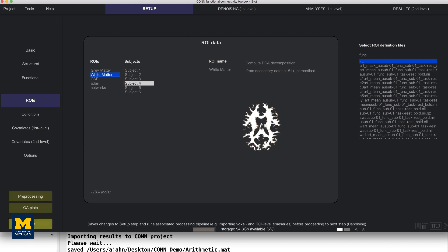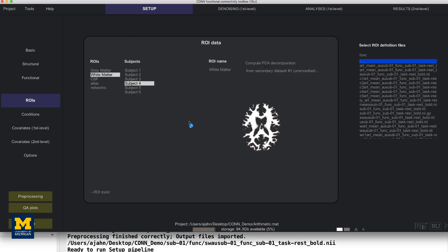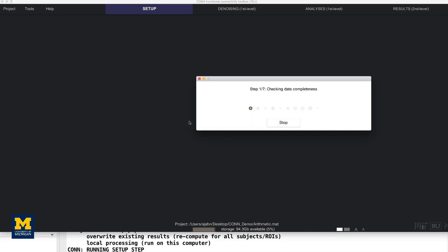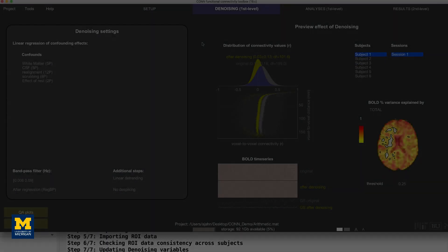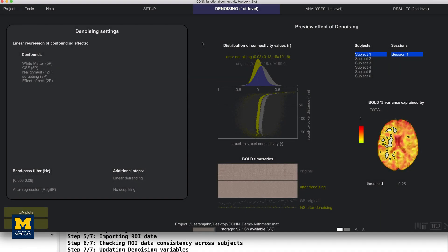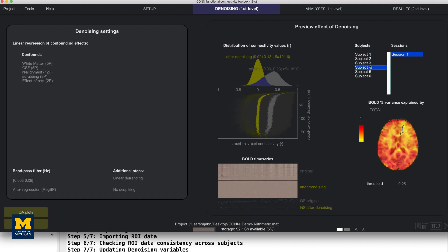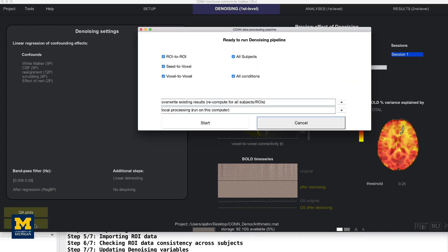Now, click on Done to begin denoising. This will take a few minutes per subject, and again, we're going to fade out here and come back when it's finished. When denoising has finished, click on the denoising first-level tab to review the effect of accounting for different confound regressors. The layout is the same. The only difference is that now you can click through all of the subjects. Review them using the same criteria that we did in the denoising video, and then click the Done button to proceed with the first-level modeling.